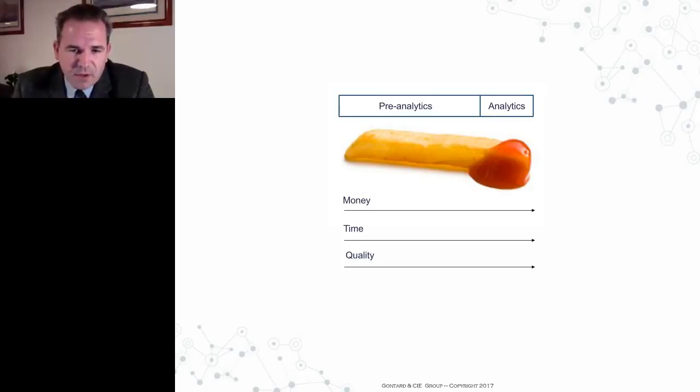If you look at the three components that are highlighted on this slide, you can do a study assay by assay and see that the percentage of money spent on the assay, the percentage of time spent on the assay, and the percentage of problems arising related to the quality of the performed assay are consistent. If you go back to literature and the IFCC study on the number of problems arising from pre-analytics, you're at 75 to 80% of problems arising from pre-analytics.